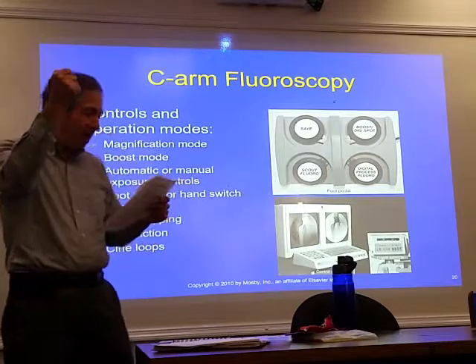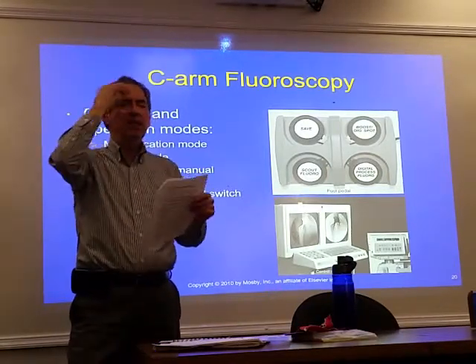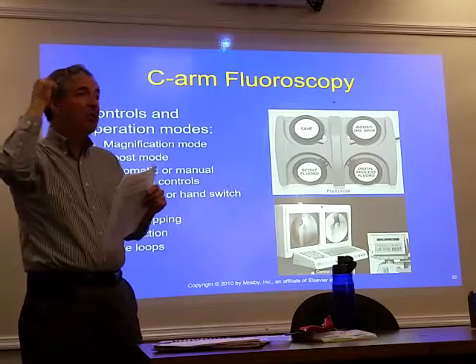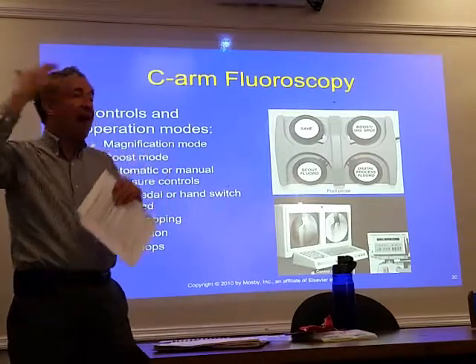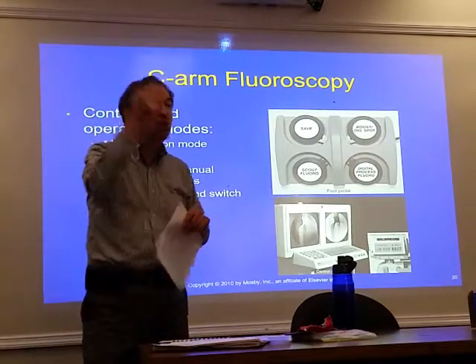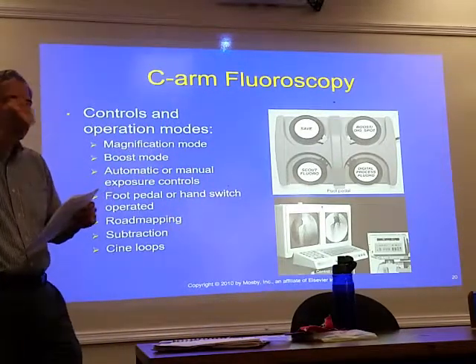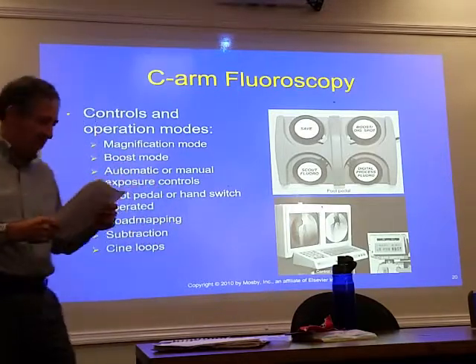When you hit that button, a lot of times on the switch, on the OECs, it looks like an eye with a plus. Have you seen that? When you hit that button, there's going to be an audible sound. And Bob was nice enough to tell me that by law, it has to make that sound, okay? That means there's extra dose coming out of that tube, so it's kind of a warning for everyone. When that plus sign is not activated, it doesn't make a sound when you hit that X-ray button, okay?